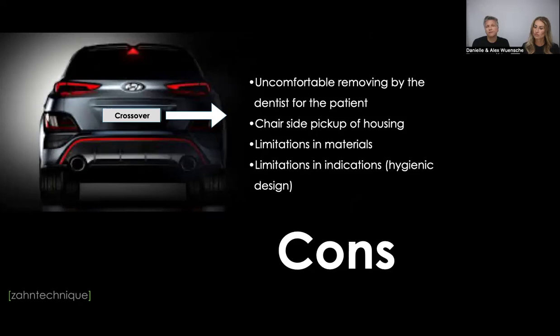Also a con is maybe the limitation of materials. Ideally, these cases are not done in zirconia, for example. It's definitely done in acrylic. It's just easy to repair if something happens to it, and it's a nicer situation. And what's also important on the Locator Fixed specifically is the limitations and indications.